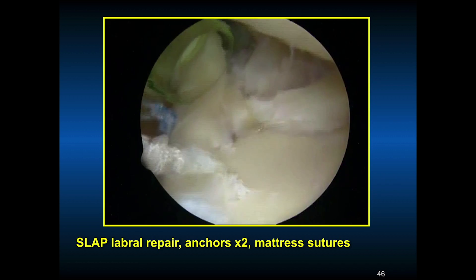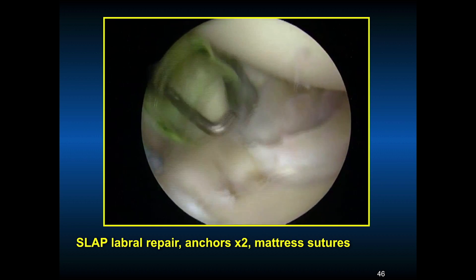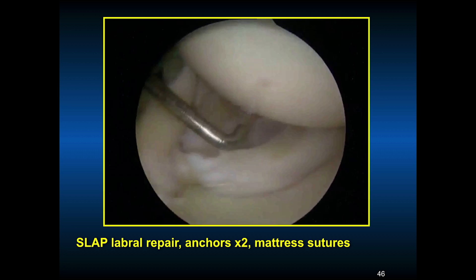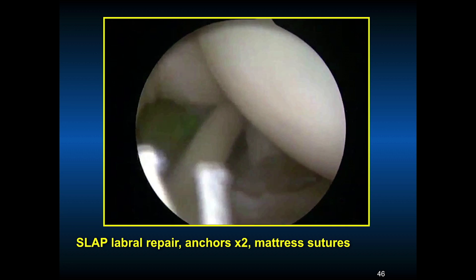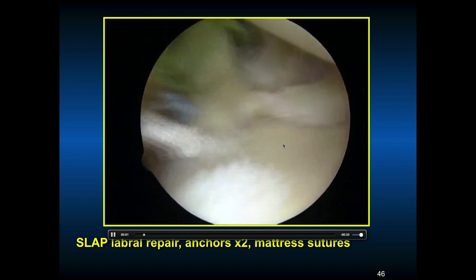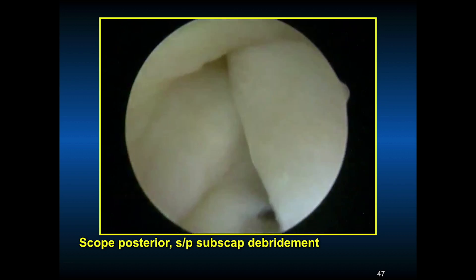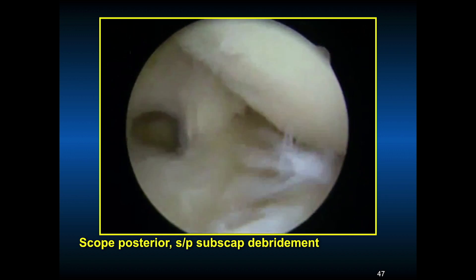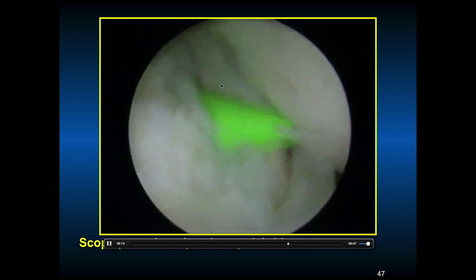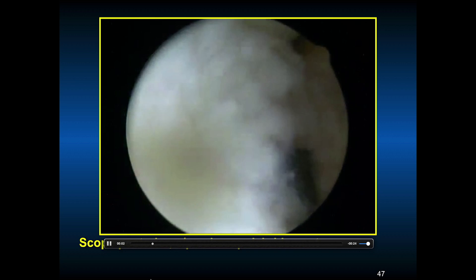This shows our repair using two anchors. You can do simple sutures, but oftentimes I prefer mattress sutures so the knots are away from the articular side — sometimes sutures can make the shoulder squeak, and mattress sutures re-approximate the labrum better. You can see the biceps is now under better tension. The sub-labral hole was left and didn't require fixation because it's a normal variant. The scope posterior shows the subscapularis debridement — getting it down to more normal tissue. The subscapularis starts on the lesser tuberosity. We decided not to repair it because it was not loose and was only estimated at 10% torn.